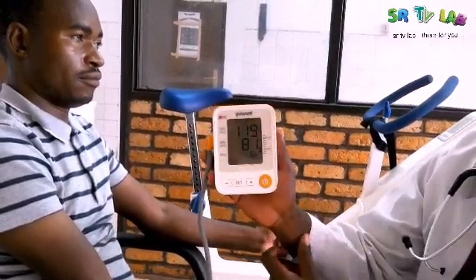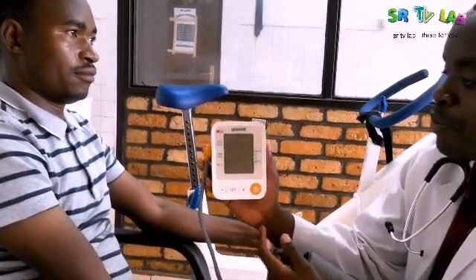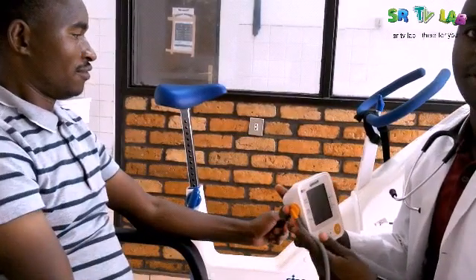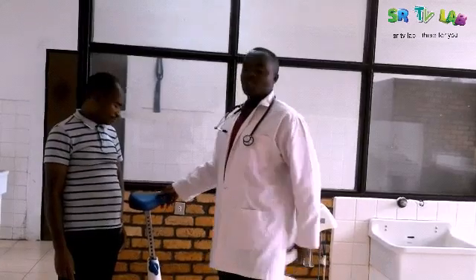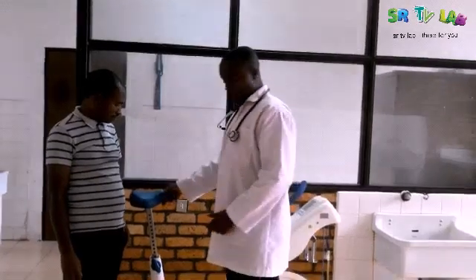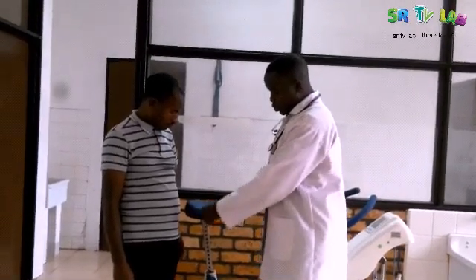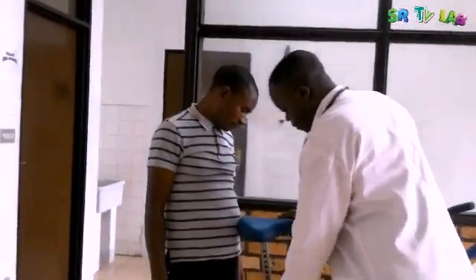The heart rate is 66 beats per minute — that is very important. Now our patient is going to go on a bicycle to see what is going to happen. The next step is to use this bicycle to see what will be the effect of the exercise on blood pressure. We have to adjust this seat to our patient's height.